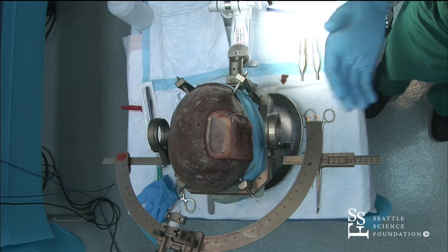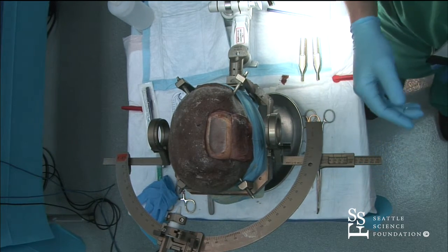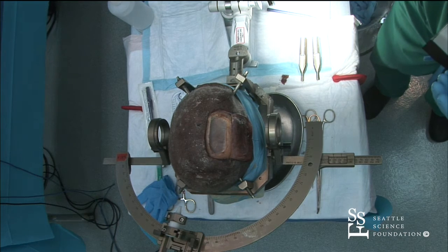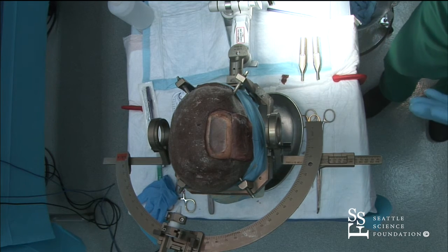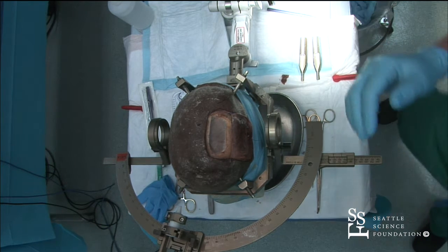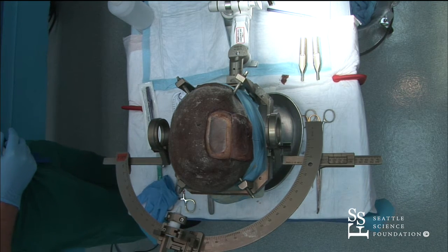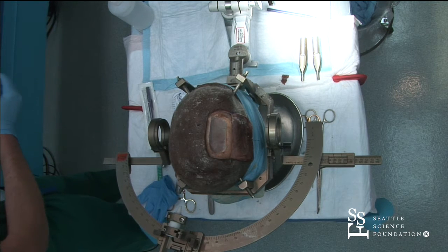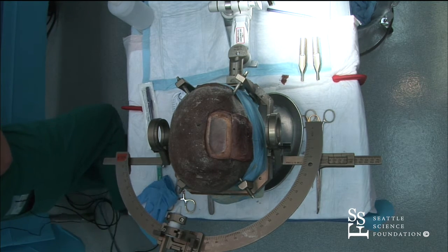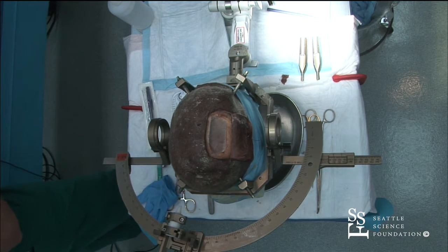Most common of that is the bilateral temporal lobe epilepsy. So we're implanting bilateral depth electrodes, and the trajectory that we use is going to be very similar to what Dr. Koh is going to show with the visual aids. Generally, we start by getting a CT scan and an MRI scan, and then co-registering the 2. And you can see here that we've already got the CT and the MR, and I've already basically created a trajectory for a left hippocampal depth electrode.